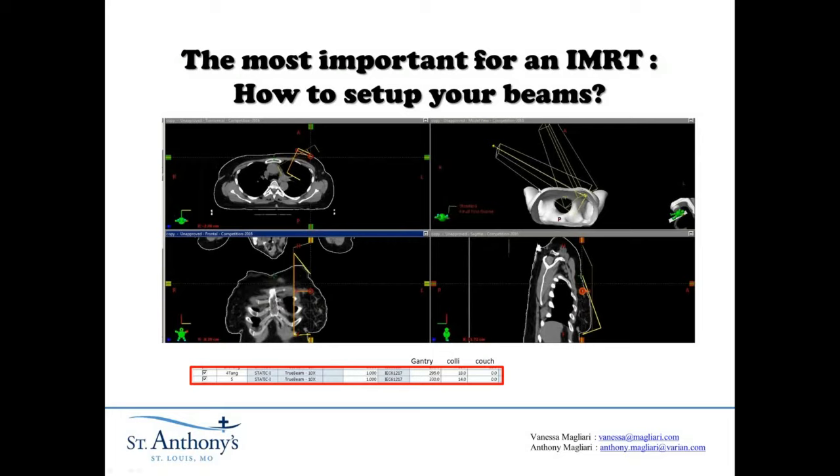Beams four and five: this one would probably be the most tangent beam you'd use in a standard plan. This is probably my second most medial beam — the first one was split into two as I went over before. You can see this particular jaw when it moves up here will define the gradient right along the chest wall. The same is true with this fifth beam — that jaw will come over here and define this line on the chest wall. You can see those two laid out here in 3D as well, and the actual collimator and gantry rotations are seen below.